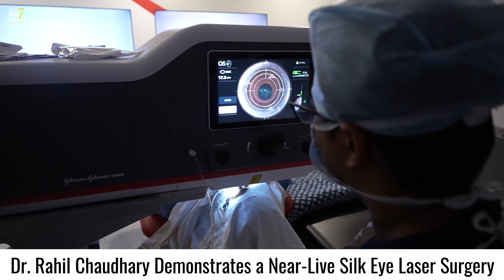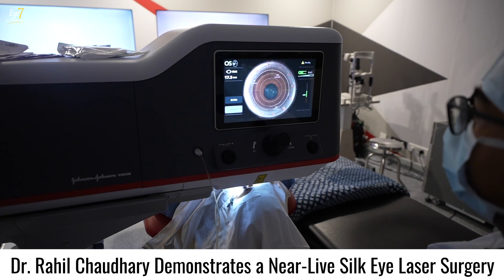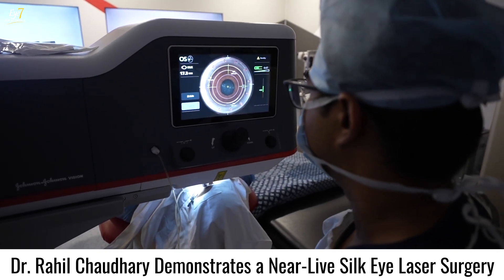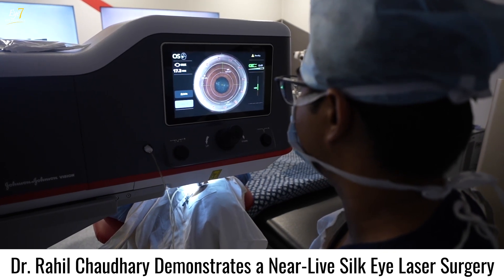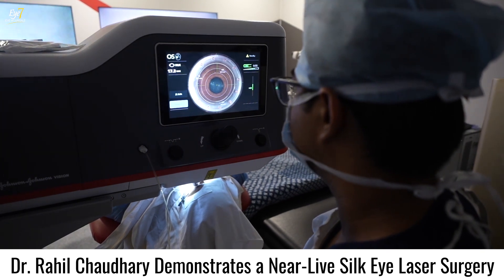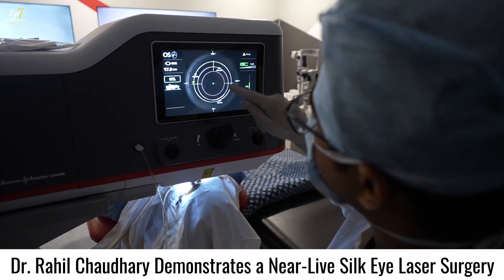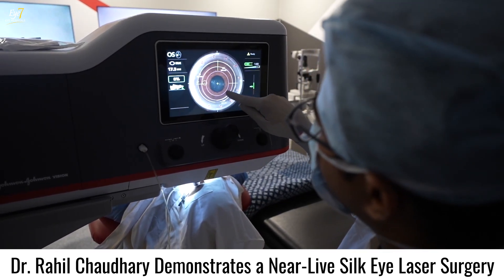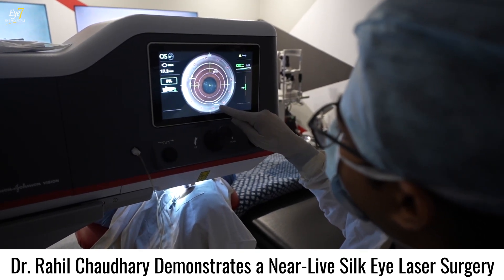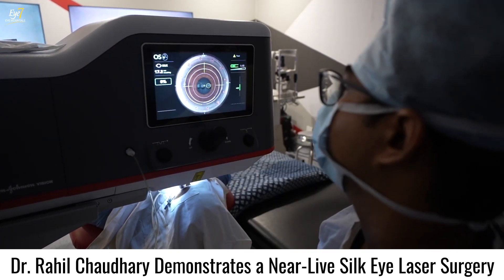We align the cyclotorsion with the axis mark that we placed at the slit lamp, then center the ablation area. You can center on the pupil center or on the visual axis center — either works. We are taking an optic zone of 6 mm with a transition zone of 7.6 mm and an opening of 3.5 mm. We are good to start — laser time is about 17.3 seconds.